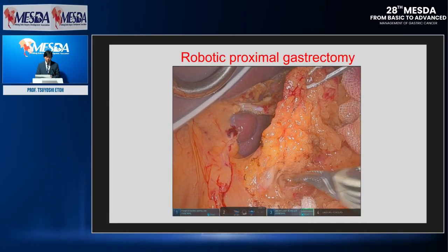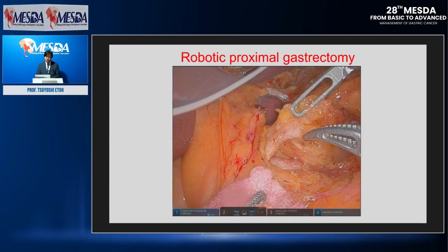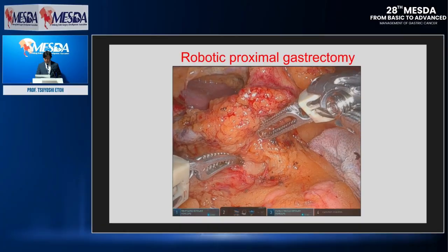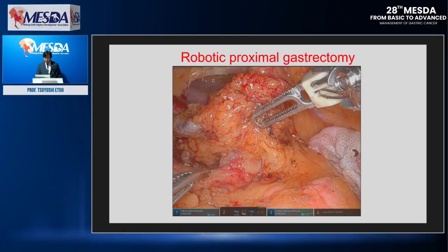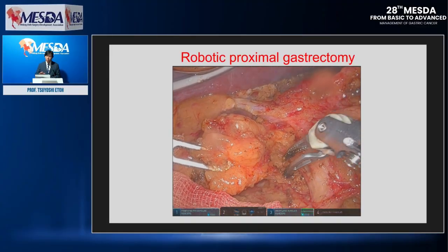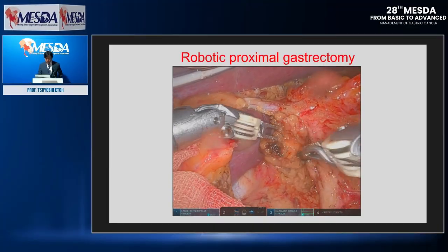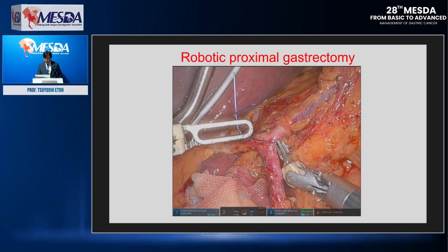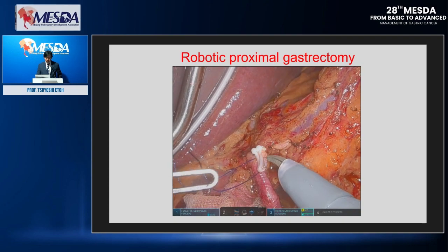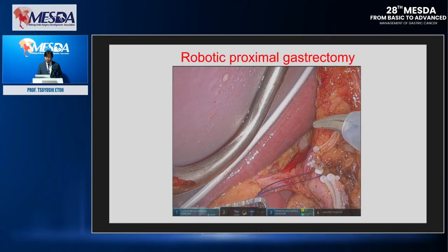During lymph node dissections, the outermost layers concept and total mesenterectomy are important. During the outermost layer approach, we have to preserve the nerve around the artery. Such a precise procedure is very suitable in robotic surgery.